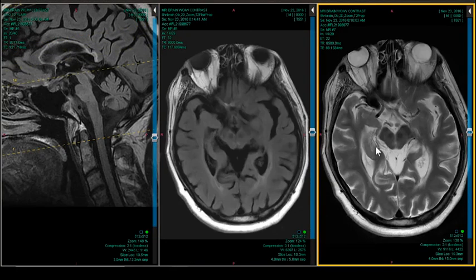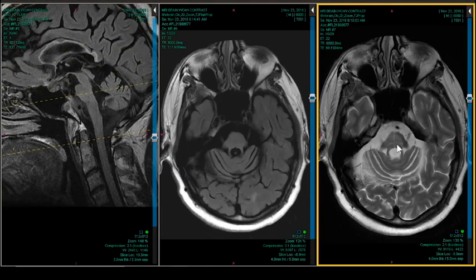And also this one has an interesting finding because I put it on there. See this view right here? This Series 7, Image 10. See, there's a line here on the pontine median raphe and one going across. This is the hot cross bun sign, okay? So this person had a multi-system atrophy.